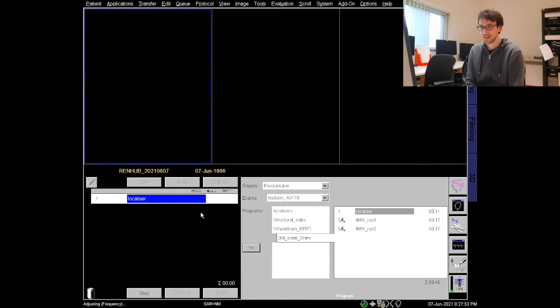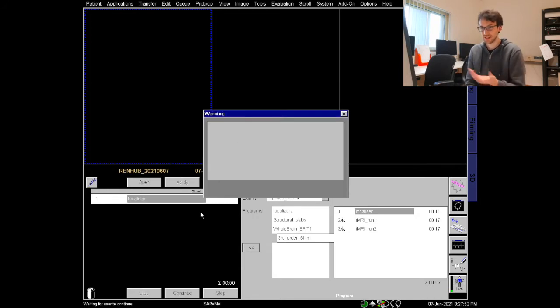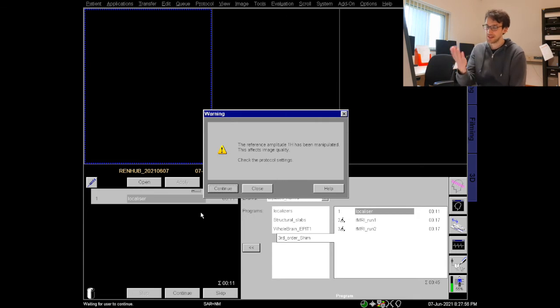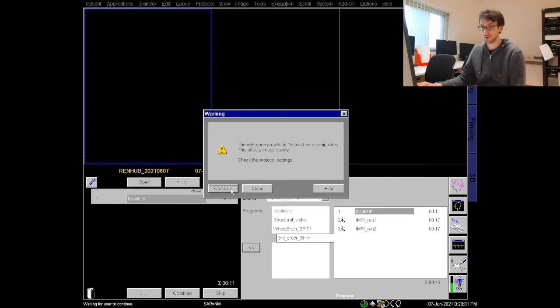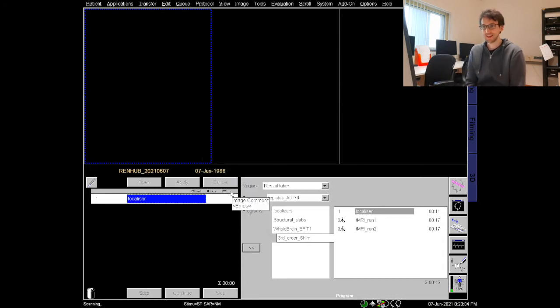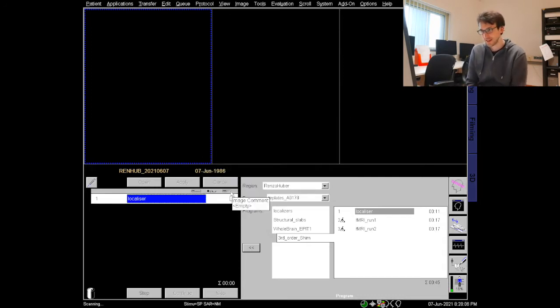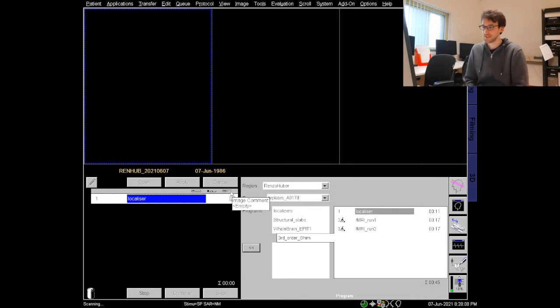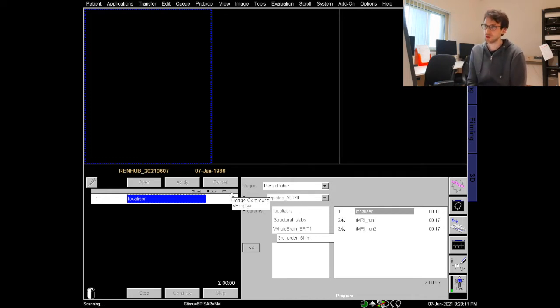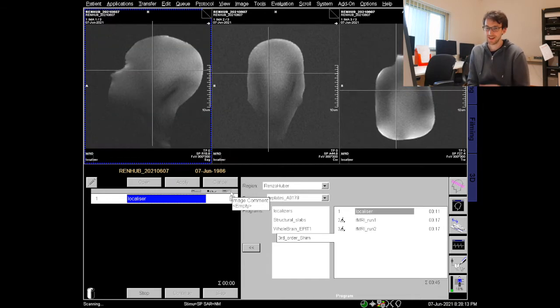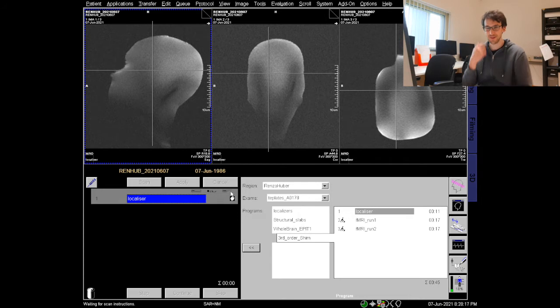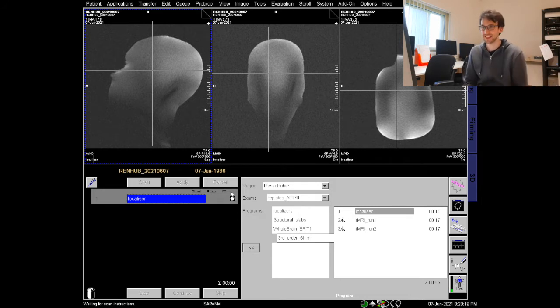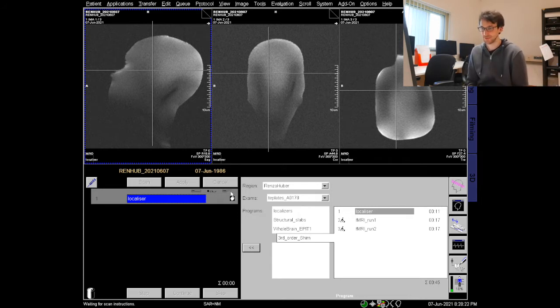Now it usually spits out a few warnings. For example, the one that my transmit voltage has been adjusted. Of course it did because I don't want to do a transmit adjust for the localizer so I click it twice. Then maybe the next one. Okay this was it in terms of warnings. Sometimes there are warnings about peripheral nerve stimulation very often and you can just click them okay because in our common practice at Scannexus we tell the participant before they go in that they might experience peripheral nerve stimulation.